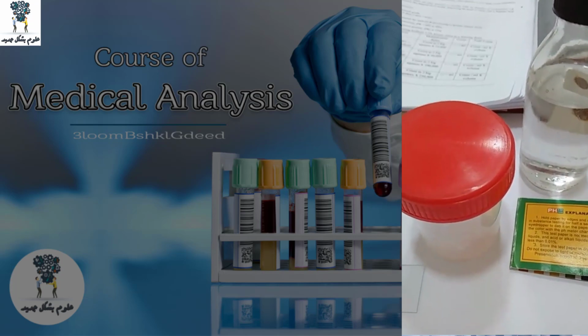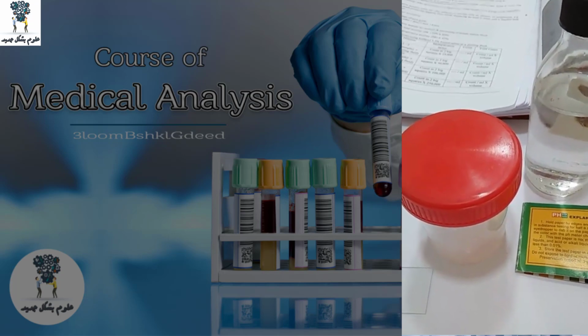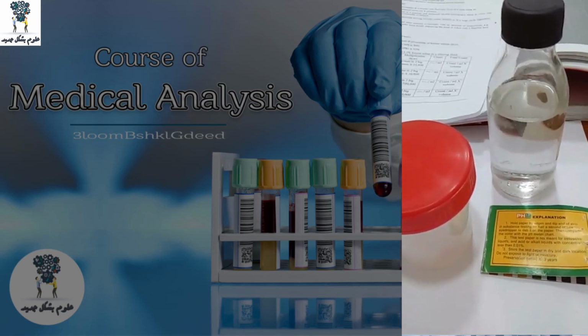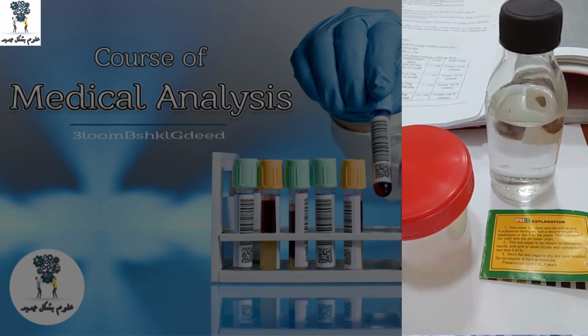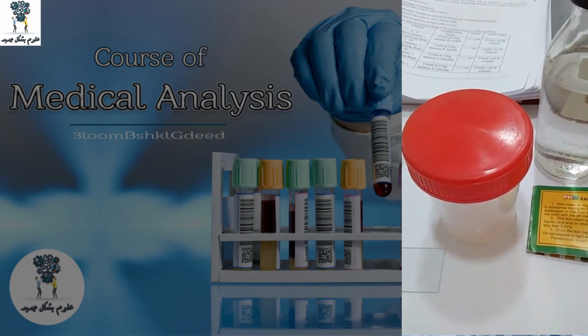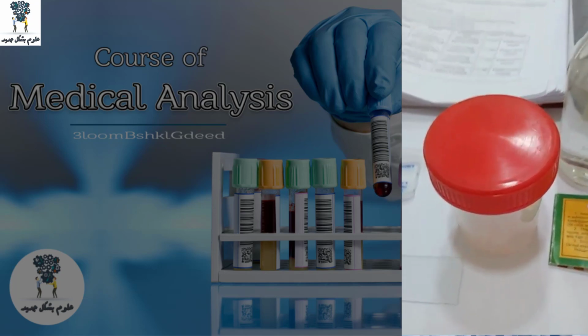So we discussed that if the activity and motility of sperm is less than 30%, we will check vitality. The meaning of vitality is that we will use a dye. It's called eosine. It's a special dye for semen analysis. After that, we will check the count.